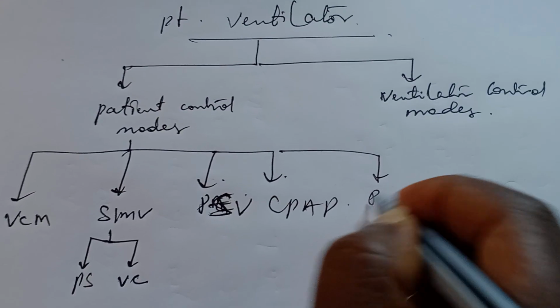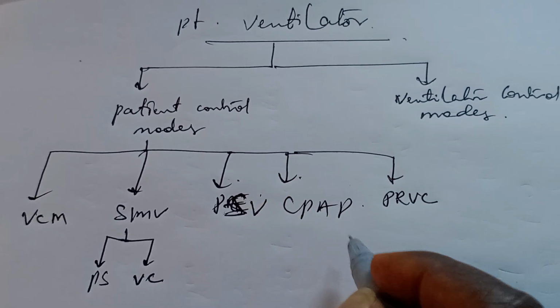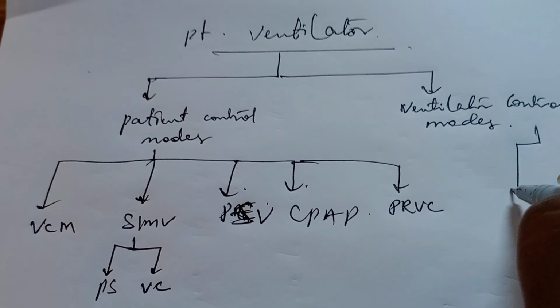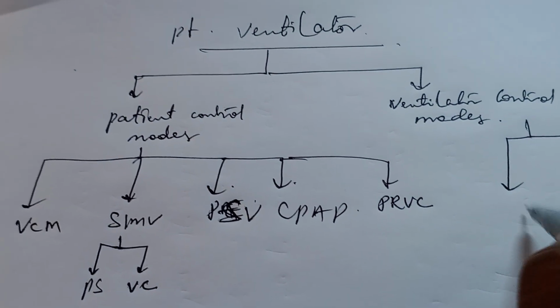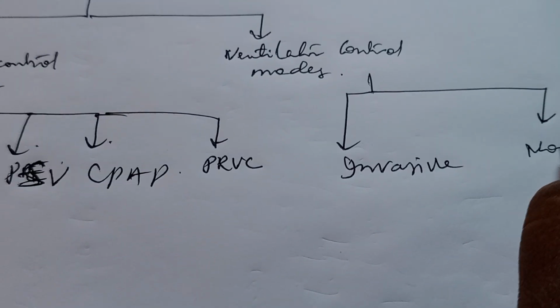Another one, PRVC. These are patient control modes. And machine control modes: invasive and non-invasive.